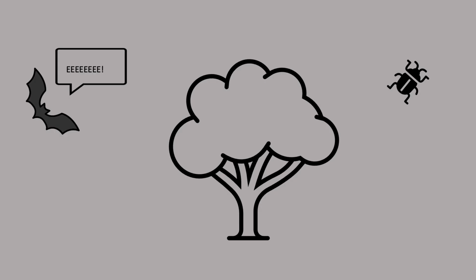Now, we've been talking about waves as a continuous wave, which is important and does play some role in ultrasound, but it's equally important to understand that the majority of times that we're holding an ultrasound probe, there's actually no sound being emitted. And the analogy I like to think of for this is bats. So we all know that bats use ultrasound to echolocate or to navigate through the night sky to be able to catch bugs and whatever else that is that they hunt for.